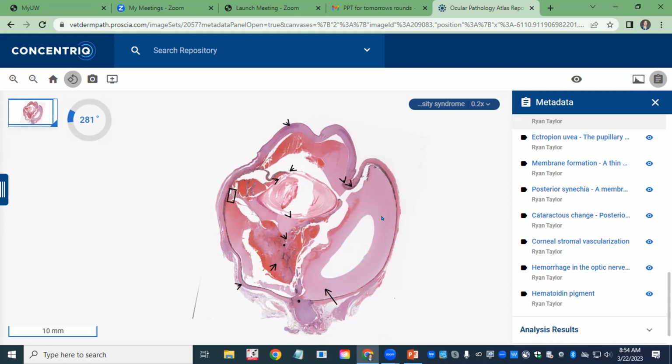And the thing that clues us in histologically is this really densely proteinaceous exudate. When you have systemic hypertension, you have all that hemorrhage, you have the retinal necrosis, the retinal detachment, the uveal necrosis, but the serum that is associated with the hemorrhage shouldn't be this densely proteinaceous, which is manifested histologically as this really, really bright eosinophilic fluid. It should be less pink, still pink, but less vibrant, less magenta. Think of a color that's less magenta and more light pink.